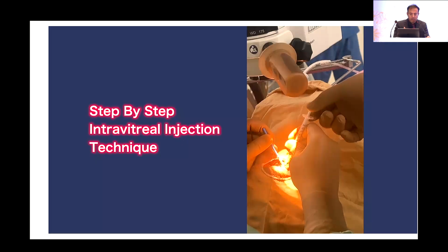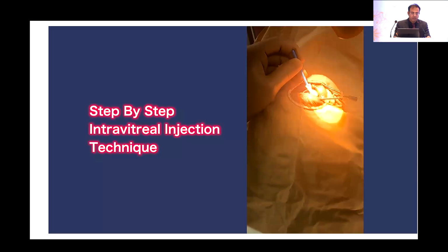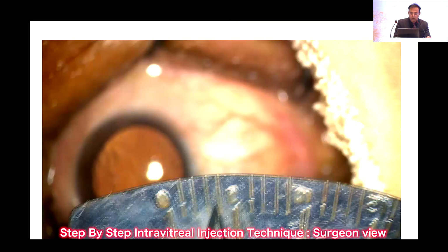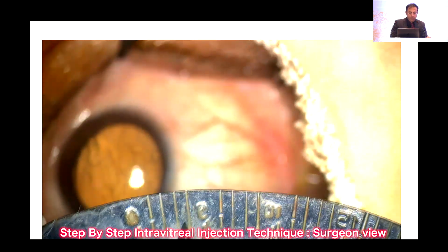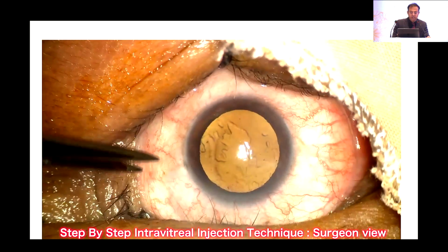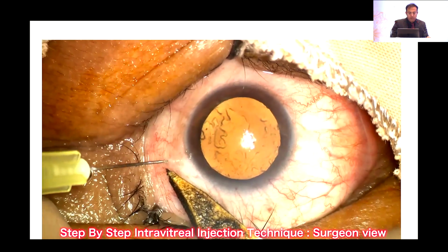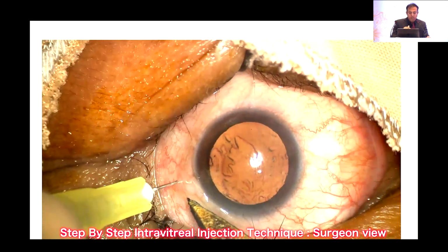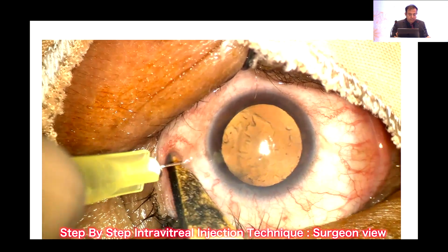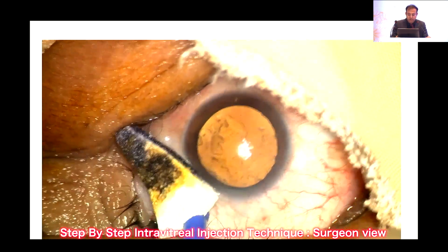You have to give the injection right into the center, into the core. You don't even need to see the opening of the needle. So once this is done, this is how the surgeon sees through the microscope, 3.5 mm. Now you can see we are marking it with our caliper. This is how the needle goes inside, and you can see the gush of fluid going inside. You have to put only 0.05 ml, and then you can just close it.